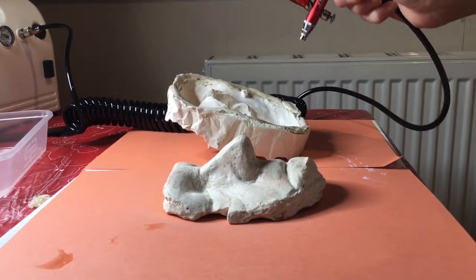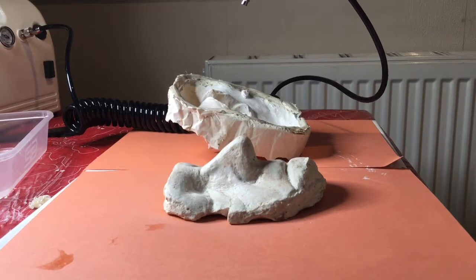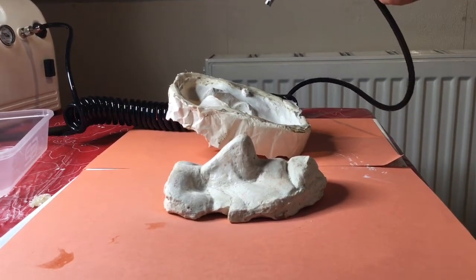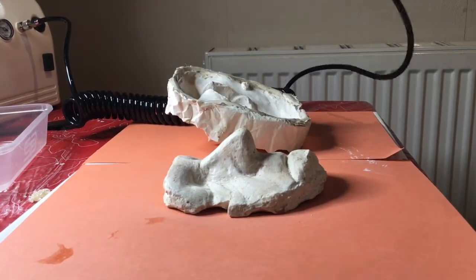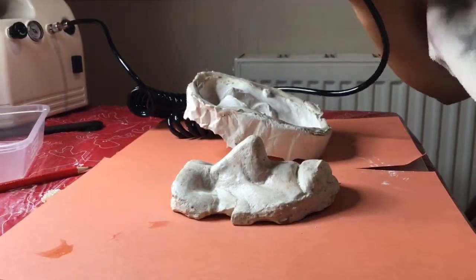Although you can't see in the video, whilst I was using the hairdryer and airbrush, I took great precautions to ensure that there was no trailing wires around me because it was a trip hazard, which is something I wanted to prevent if possible, as it could cause serious harm to me or someone around me, and would look very unprofessional since it is a hazard that can be prevented.